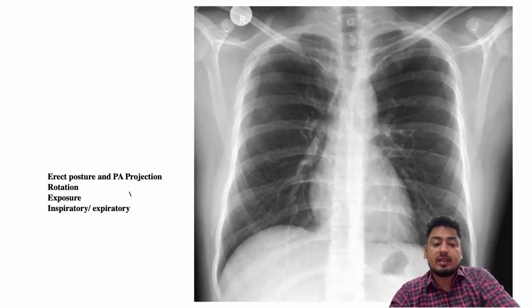Then you have to tell whether the film is inspiratory or expiratory. Then you will tell me in the comment section how you can tell whether the film is inspiratory or expiratory.